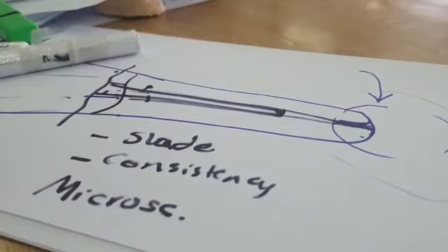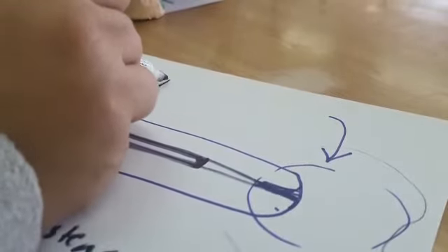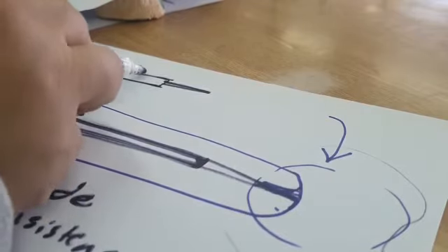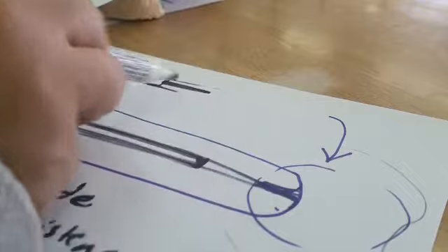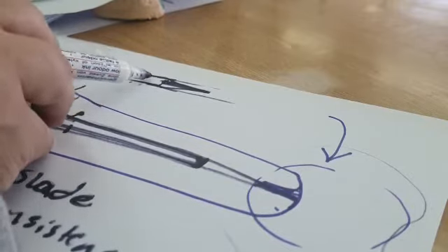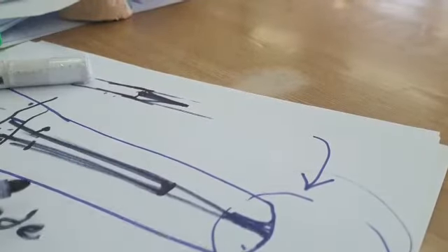What other options do we have? The last option is that there are some post systems, they have what they call post removal kits. They have a drill, it's tapered, and it has safe cutting ends here. What do these do? Because they're safe cutting, they don't cut dentine, and this is only cutting in the center. You verify that you're always in the center in the canal, because these are the canal walls, correct? This is only cutting in the middle, and it's tapered towards the safe end cutting walls, it always verifies that you're inside the canal. So you will not go laterally in the canals and do any ledges or drilling.